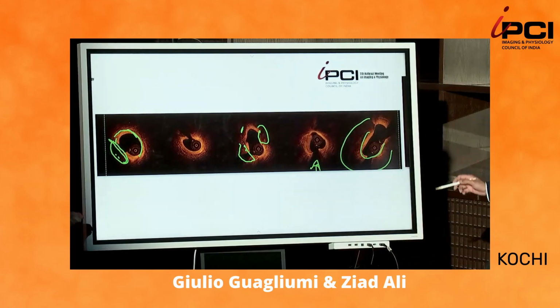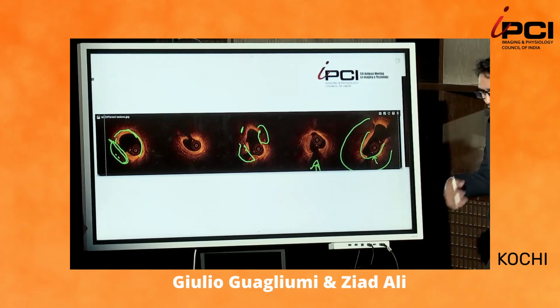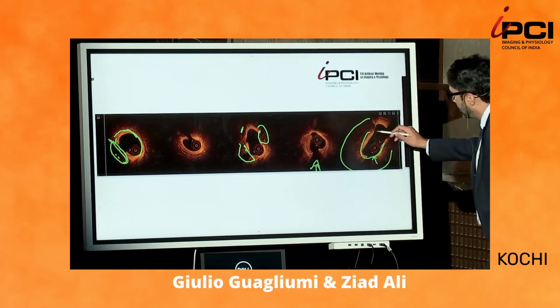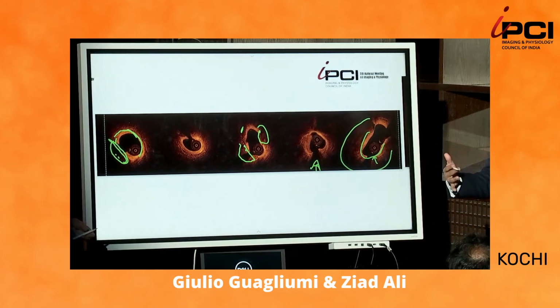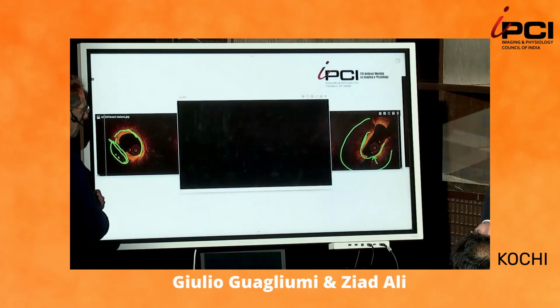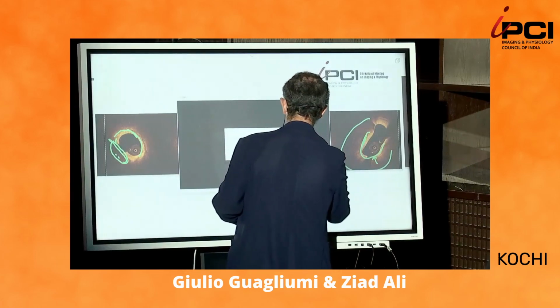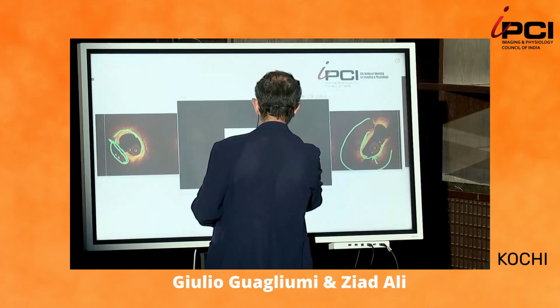The other important thing to always note is the more superficial your calcium, the better the impact of atherectomy-based devices. If you have a covering that's like a pillow on top of a plate, when you put a pillow on top of a plate, if you use a drill, it won't hit the plate. What you need to do in that situation is think about things that squash the pillow, like a balloon where you can deliver lithotripsy.